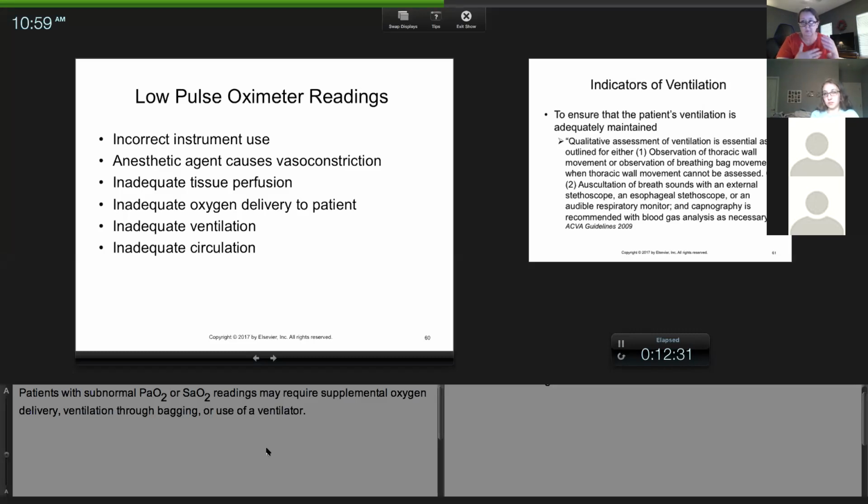This is all troubleshooting we're building. How are you going to determine that it is correct versus a probe issue? A lot of people like to just blame the machine and leave it alone. But there are things you can do to figure it out. You don't just go, oh, it's a crappy reading, whatever, hopefully my patient will live. No, we are going to build a list so that when you're in surgery or radiology, you'll have a pulse. In radiology, all you'll have is your stethoscope and you, but the only monitor will be a pulse oximeter. So I'm going to stop there.